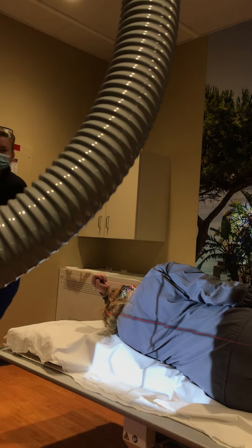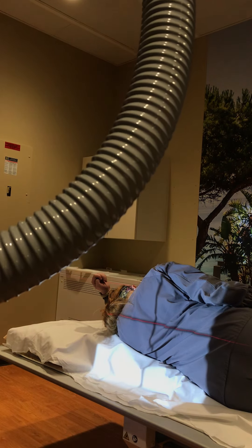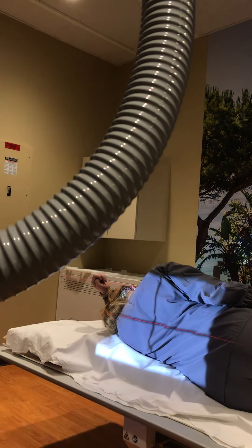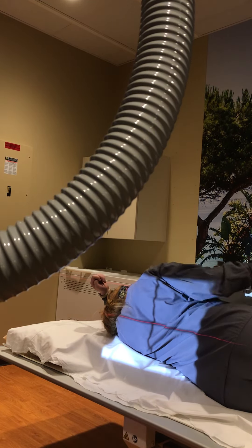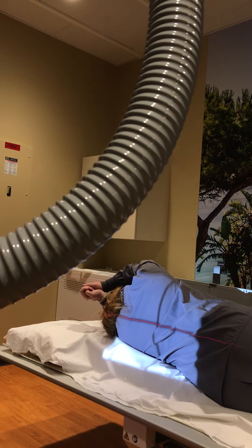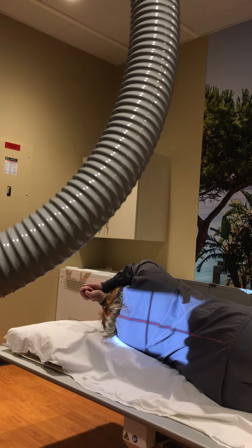So I do have her propped up on a sponge to make sure I don't clip the bottom. My centering is going to be T7. I'm going to have you rest both arms up above your head — so if you can just take your right arm, and yep, perfect, thank you. So T7 — I want to make sure I have slightly more light on the wall behind the board and down on the sponge beneath her.